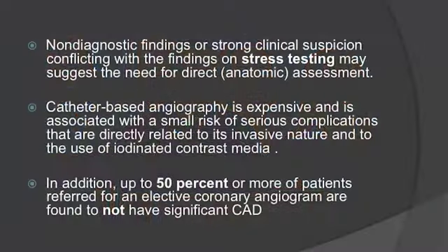Many times, non-diagnostic findings on stress tests lead to a physician asking for an angiogram, and the angiography can be catheter or CTA. One of the reasons why CTA or CCTA has taken up is because 50% or more of patients referred for an elective coronary angiogram are found to not have significant coronary artery disease.